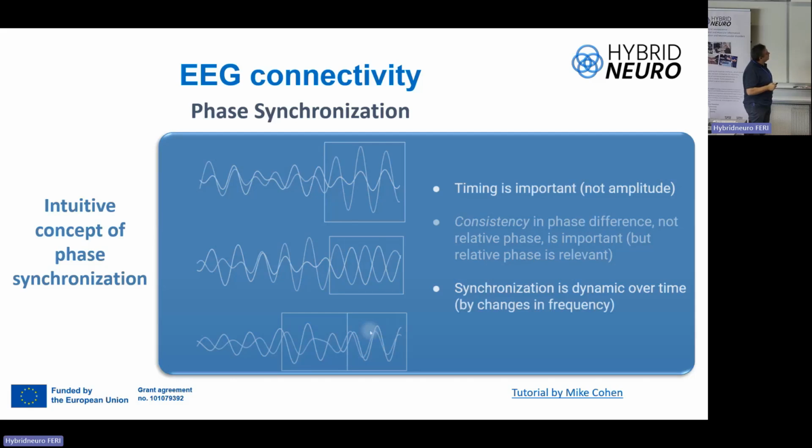Here, not, because each signal is from a different source, and we cannot see any synchronization in the phase. Starting with delay here, it's longer here. So this is the kind of information that we must analyze.